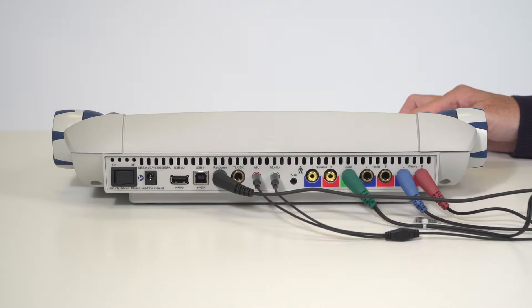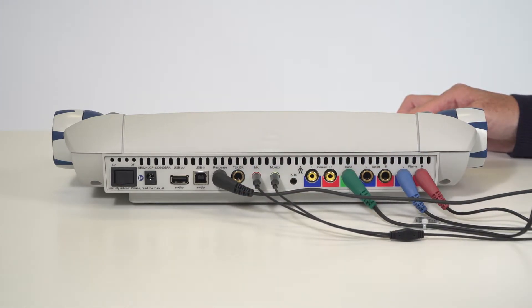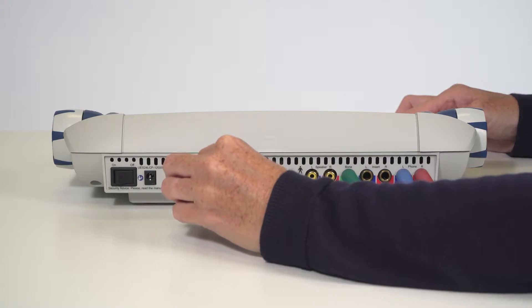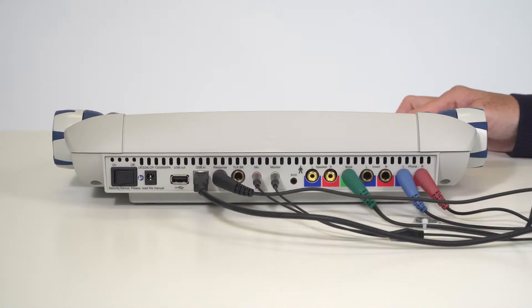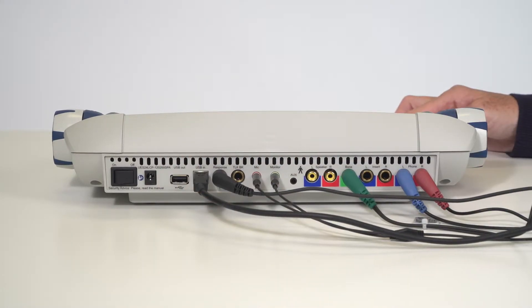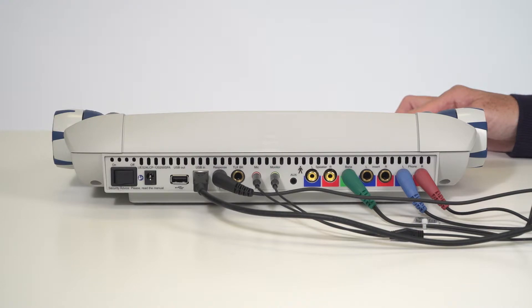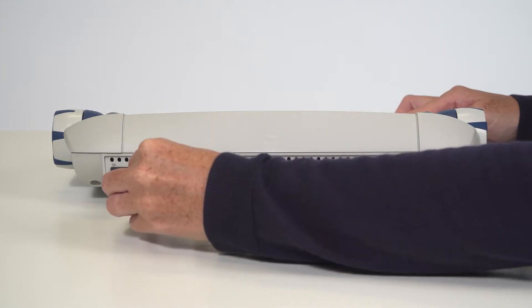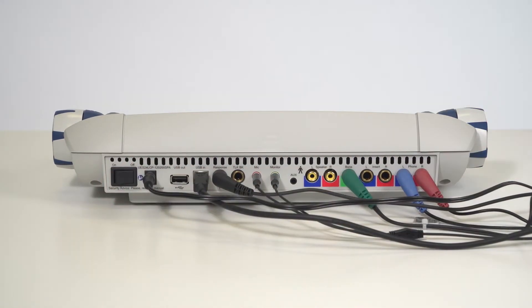If you choose to use the unit with Mako Sessions, plug in the standard USB cord into the USB-in socket and the other end into a standard USB port on your computer. The power cord is plugged into the power socket. Your MA42 audiometer is now ready to use.